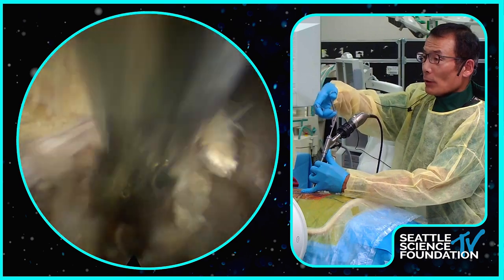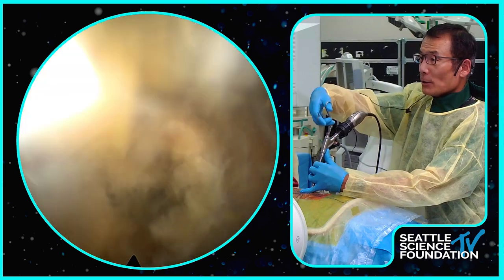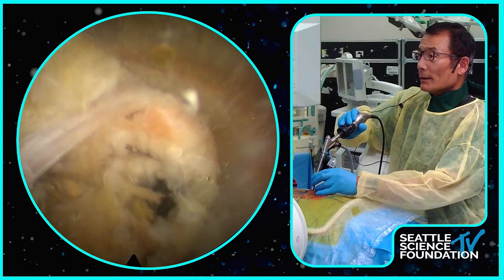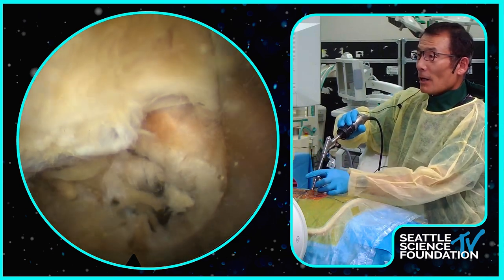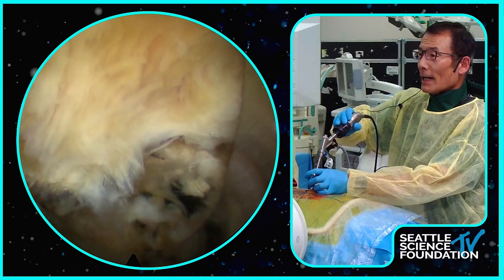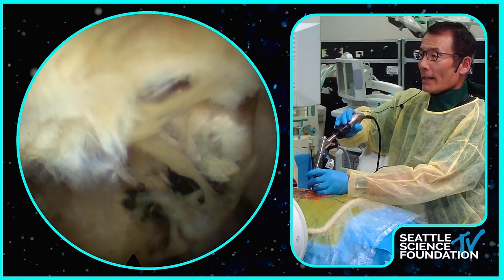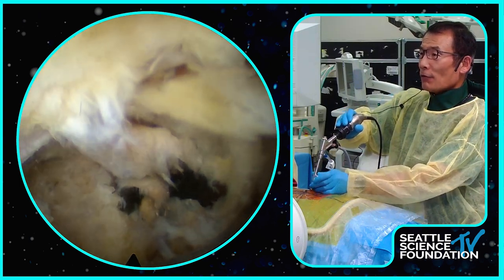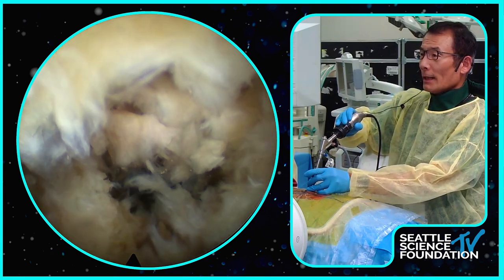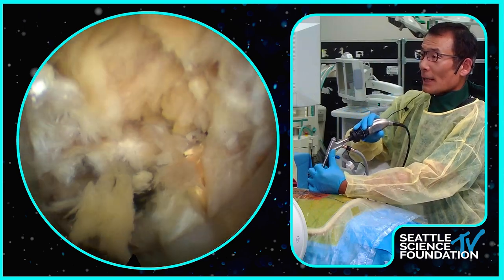So for this approach, we want to minimize the retraction of the thecal sac or the traversing nerve. So when I do the discectomy, first of all, I leave the ipsilateral ligamentum flavum there. I take that out after I place my cage. So that acts as a protective curtain for the ipsilateral traversing nerve. And I already did the decompression laterally all the way.